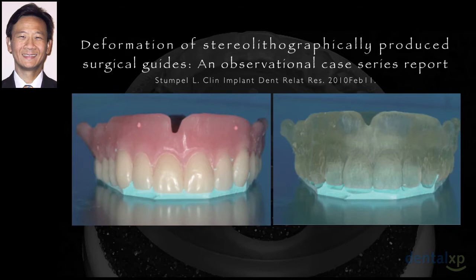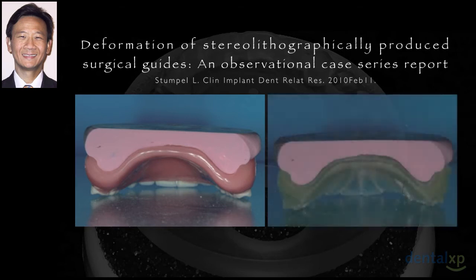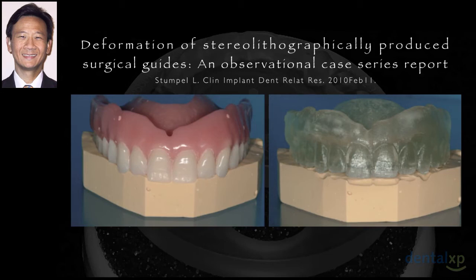He then took the same putty matrix or material and looked at the intaglio surface. Was the intaglio surface different to the duplicate denture? Well, it was slightly off. It wasn't as precise a fit of the intaglio surface of the radiographic template versus the CAD/CAM duplicate denture. He then took a patient and looked at it from a stone index. Maybe it was the materials. But again, the occlusal index to the duplicate denture with a stone index was very far off.